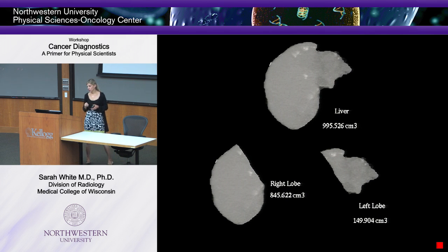And these are the liver volumes that we've done. She had a very small left lobe compared to her whole liver, and we actually treated this woman, okay, with radiation. I don't have the results yet to tell you, but I'm optimistic that this actually will work for her.